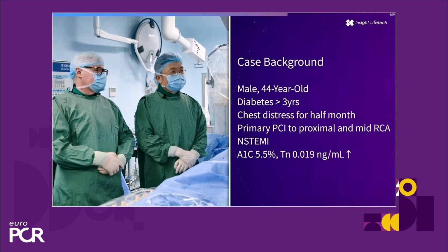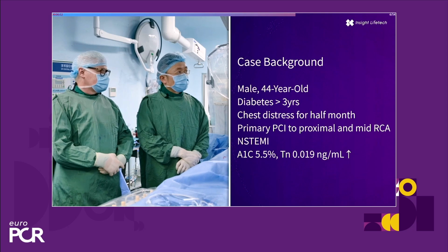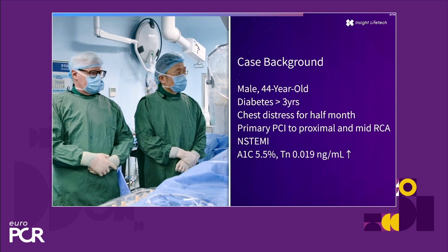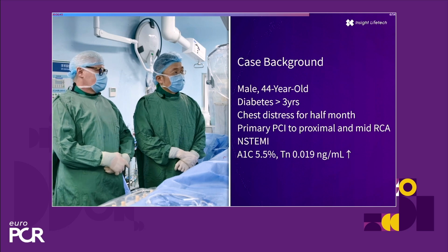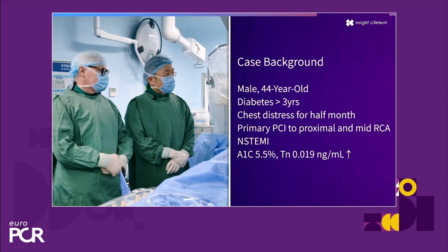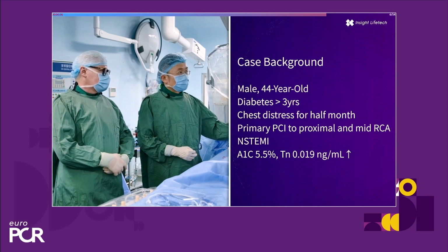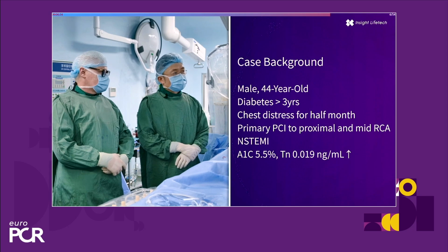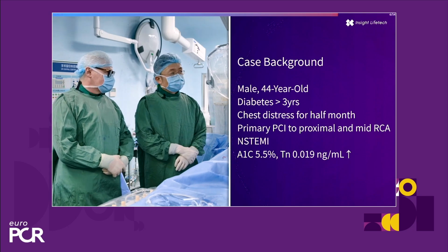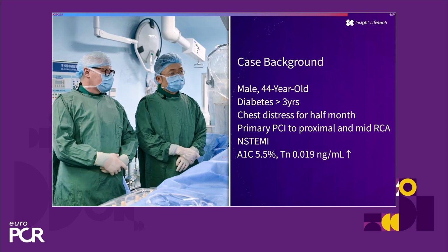So today we have a very interesting case. Briefly, this gentleman had an acute inferior myocardial infarction 1 month ago and was successfully treated with primary PCI in a local county hospital. So today we can see the RCA stent is patent, and the electrocardiogram shows only a small Q wave in lead 3. The vessel was opened very early, so most of the myocardium is preserved.